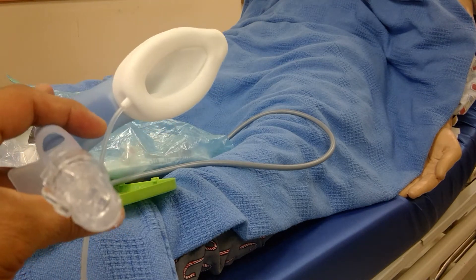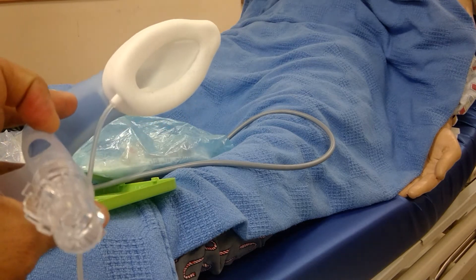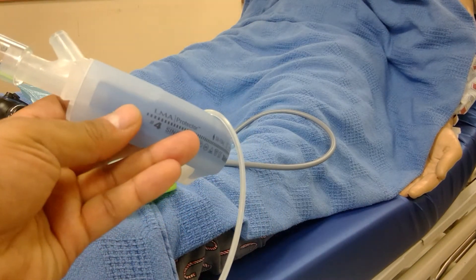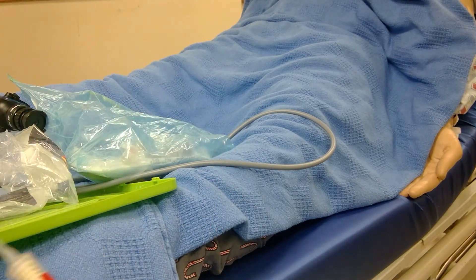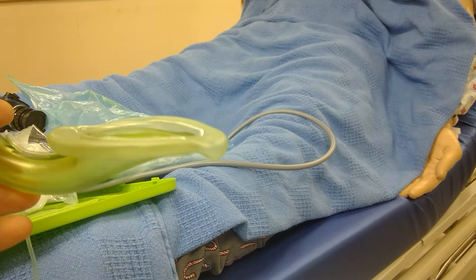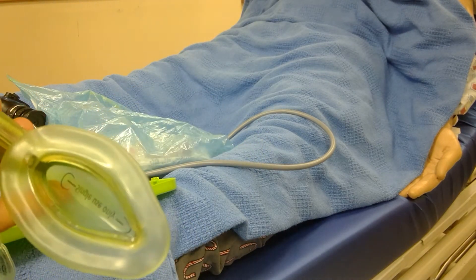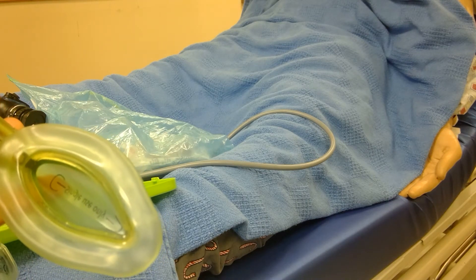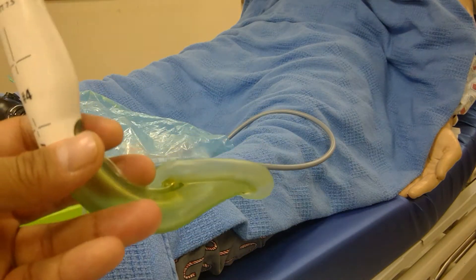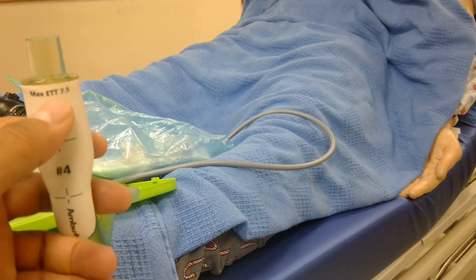It may not allow a Salem sump, but it will allow a size 14 suction catheter to pass through the side. This device allows you to intubate through it — it has a built-in bite block, sized for the LMA. This one does not allow for gastric decompression, which is its downside, but it has a nice marker right here at the tip of my finger that tells you you're in the right place if it's inserted correctly in the airway, so you look up and find your cords.